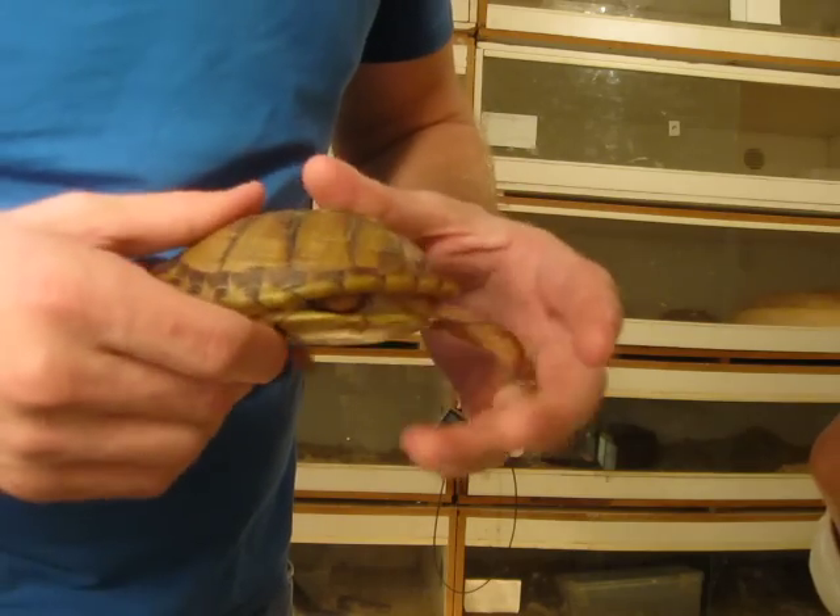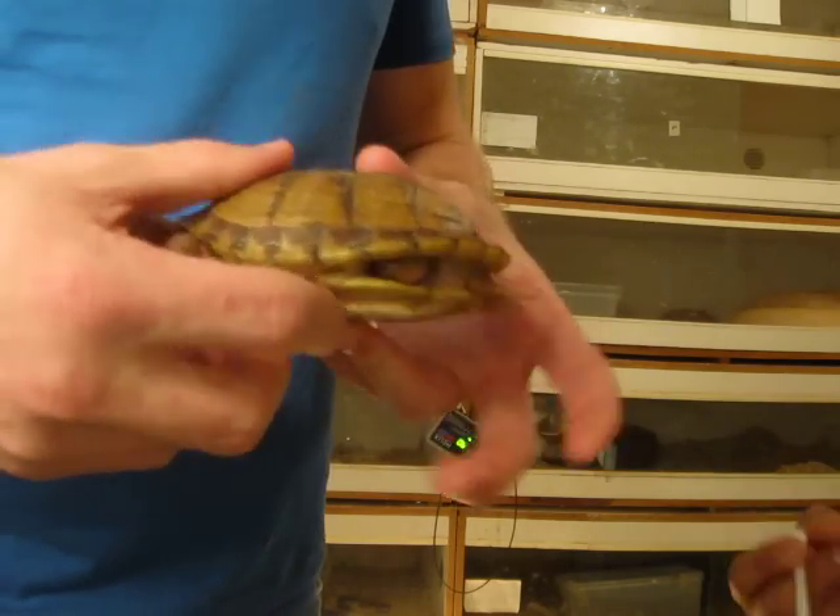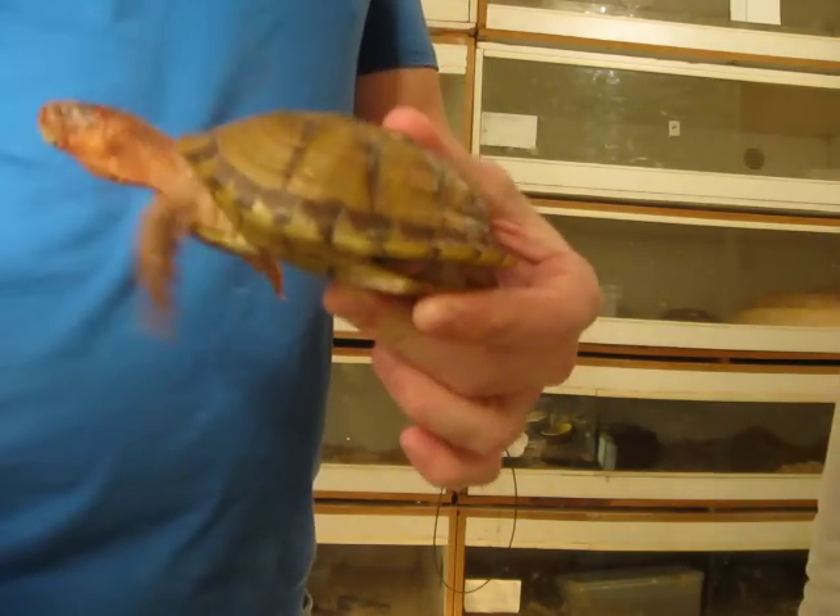See how it's dripping out a little bit there — only a couple drops. Now we're going to put it back in and hopefully he will recover.